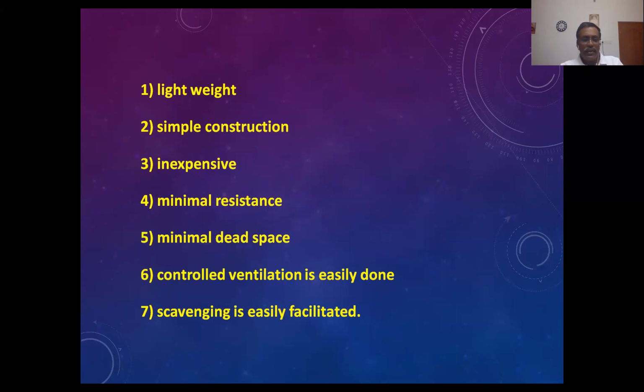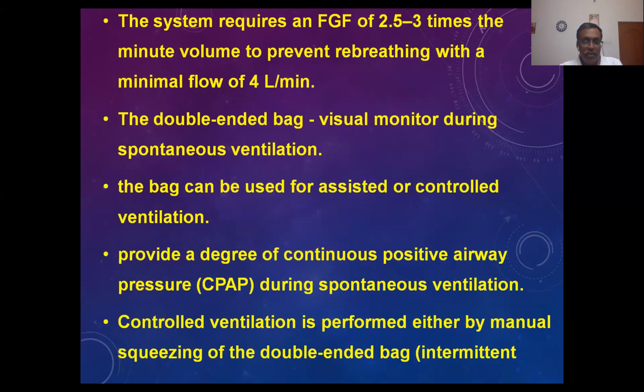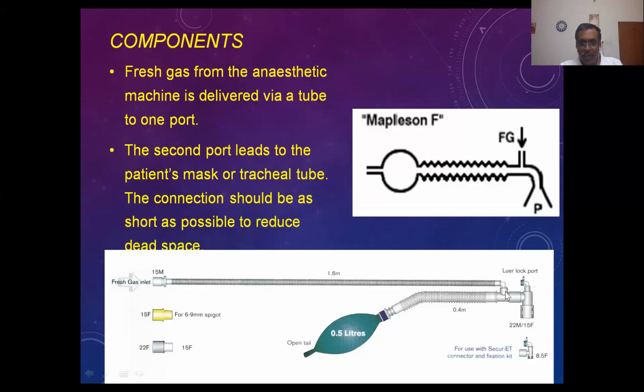Okay. So here, all the examiners will ask you, show me the dead space in the pediatric circuit. I have already told you earlier, where is the dead space? The dead space is from here, and this portion forms the dead space in the T-piece, from the fresh gas flow to the patient end. From the fresh gas flow to the patient end, this cannot be flushed out.